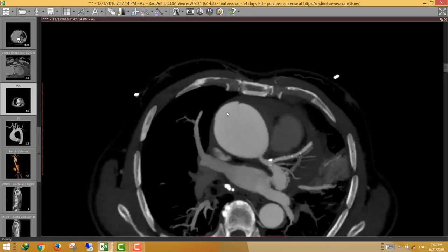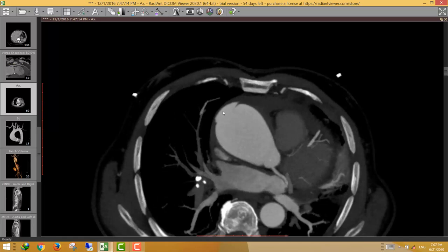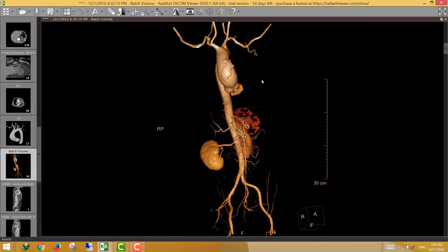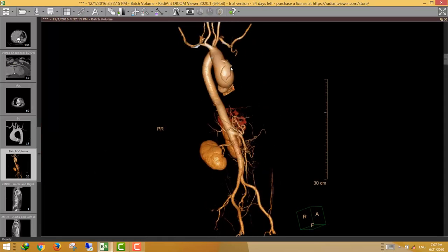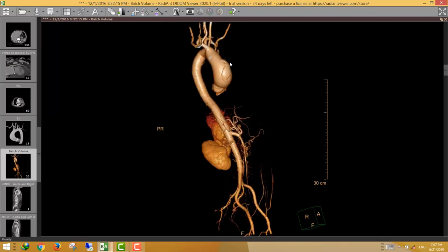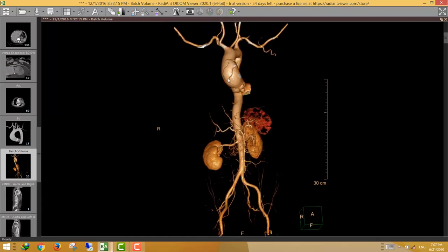The ulcer-like projection is a contrast-filled projection that widely communicates with the lumen and is associated with the intramural hematoma. It carries a very bad prognosis. This can be seen on 3D images as the outpouching along the anterolateral wall of the ascending aorta.